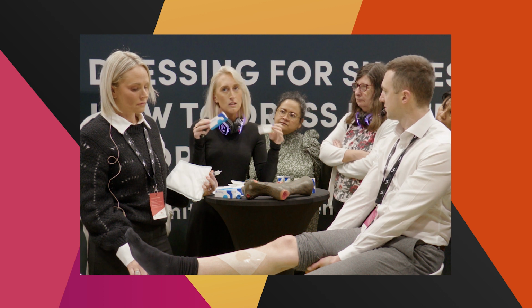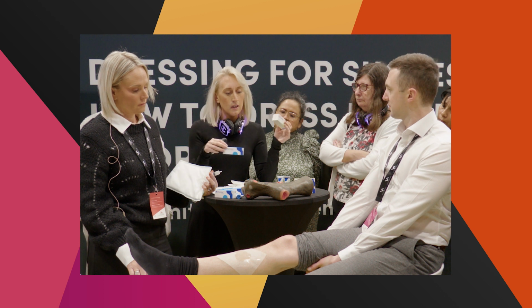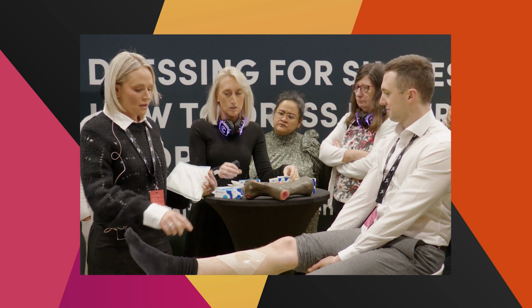So it just means you've got consistency of care, and you can switch up and down between the two. Obviously patients can do a little bit of shared care if they need to as well, because it's completely non-cytotoxic. Okay, so you've got those two on there.